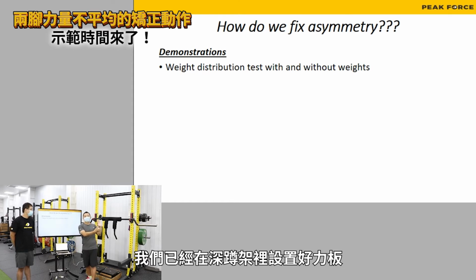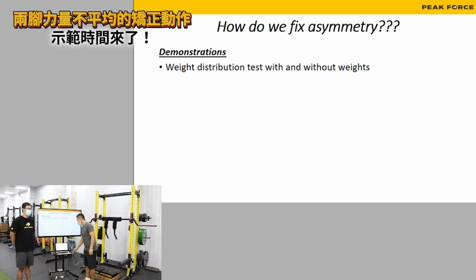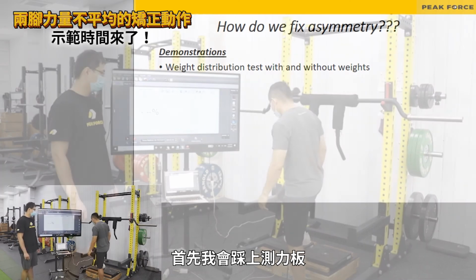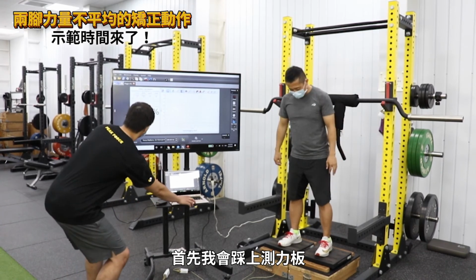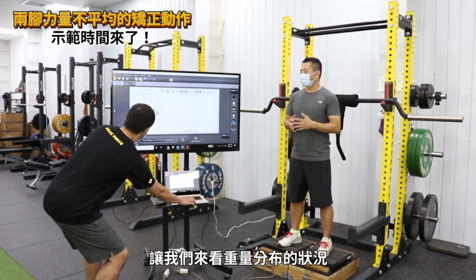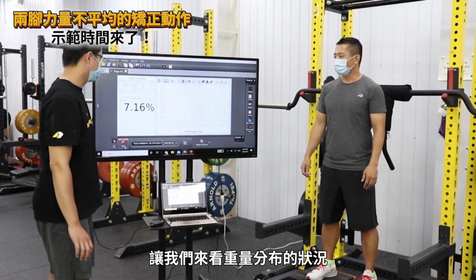Okay, so just like last time, let's do some demonstration because we have the force plate set up in a squat rack, so I can show you guys some examples of how to correct the asymmetry with those exercises. 好，那我们现在就会来做一些运动。那我们会在测力板上来让大家看到这个对称性跟不对称性的数值的部分。Okay, so the first one as a refresher, I'm gonna step on the force plate and then I'm gonna have weight distribution, and then let you click.